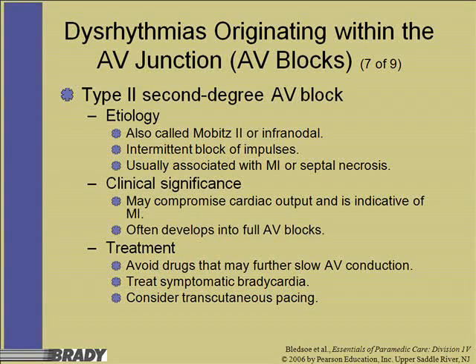And this is where another tool we're going to use on that cardiac monitor, where we place the defibrillator pads on the patient, and then we would consider pacing the patient. In other words, we're doing it artificially through the skin, where we get the transcutaneous part, and we're going to do it externally. So we will actually be pacing through those pads to the patient.